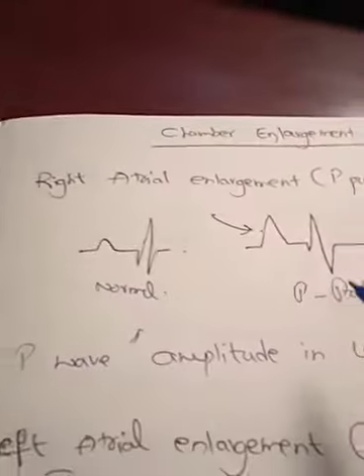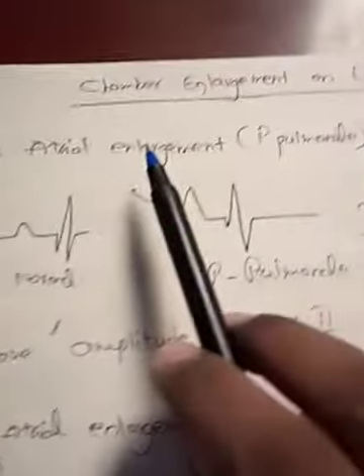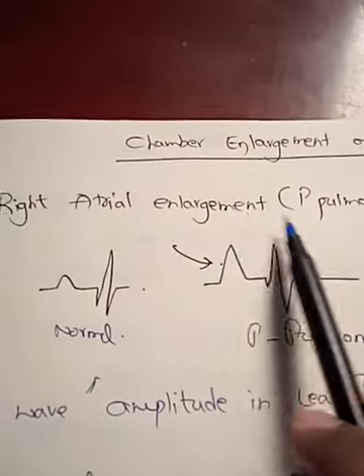Today, in the next 3 minutes, I'm going to make you the champion on how to diagnose chamber enlargement on ECG on the Incus app. Welcome to all. Basically, right atrial enlargement: how do you see it?